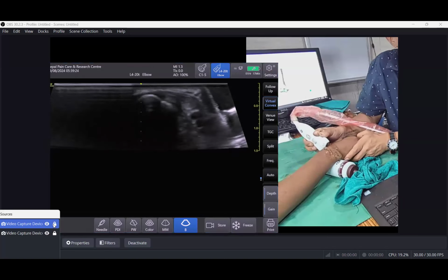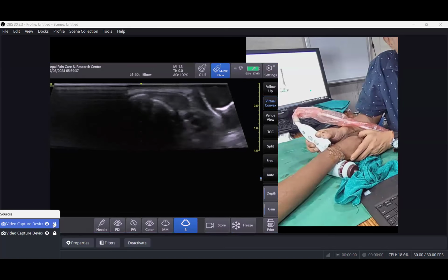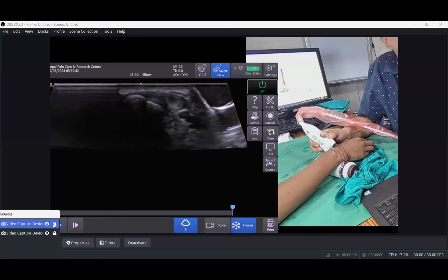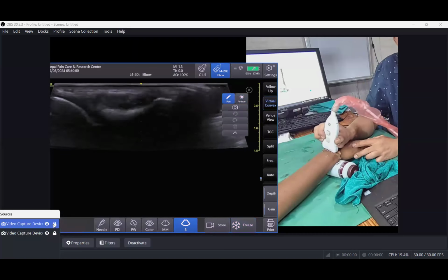The clinical significance is the Lister's tubercle, compartment number 2, and then going more towards the thumb, you can see 2 tendons very nicely. This is abductor pollicis longus and extensor pollicis brevis. This is of clinical importance where there is de Quervain tenosynovitis, where you can inject. Your needle can come like this and inject around the tendon, not into the tendon but around the tendon, in the fluid surrounding the tendon. You can inject steroid here. Are you clear regarding these compartments?